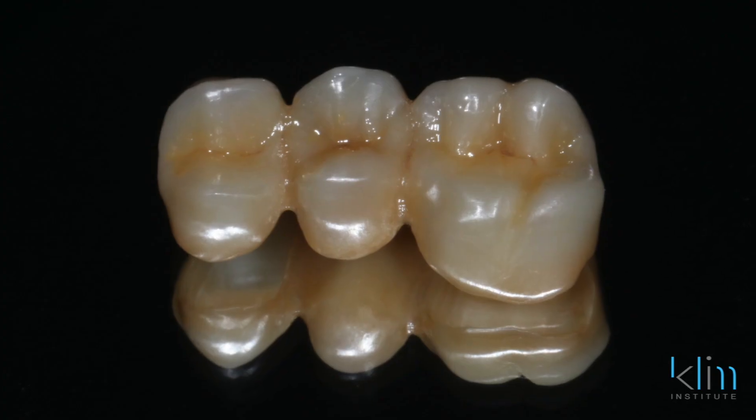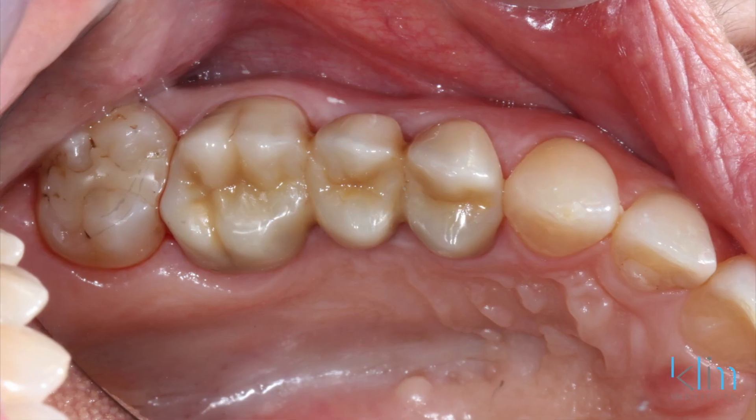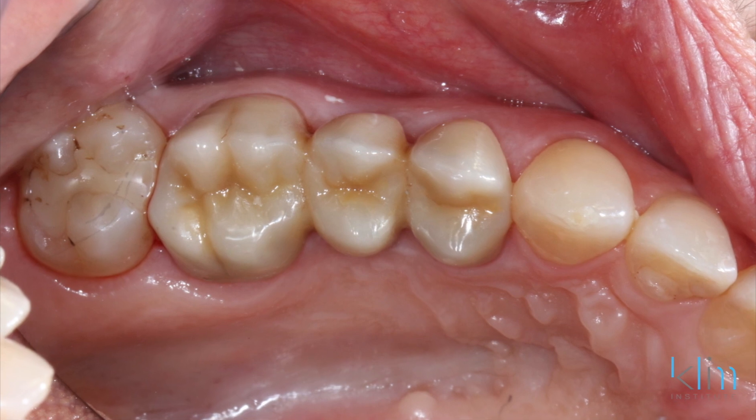The reason I use Zircad LT is for strength and thinness — it's usually on second molars or bridges into posterior zones of the mouth. My goal is to tone those restorations down so they don't create visual tension, and that's the purpose of all the restorations I do in the mouth. I don't want visual tension. Fortunately, the shades help me with Zircad LT, but to really make Zircad LT work in my hands, I have to use the Zircad LT coloring liquids.